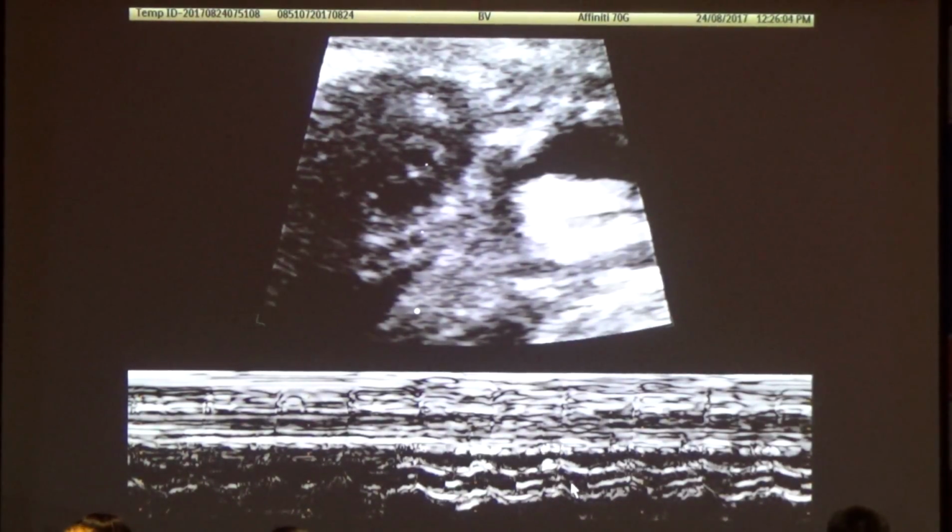that there's the aortic valve opening, there's the aortic valve closing. Opening, closing, opening, closing. That's the best box we've got there. Alright, so that's the aortic valve. Okay?